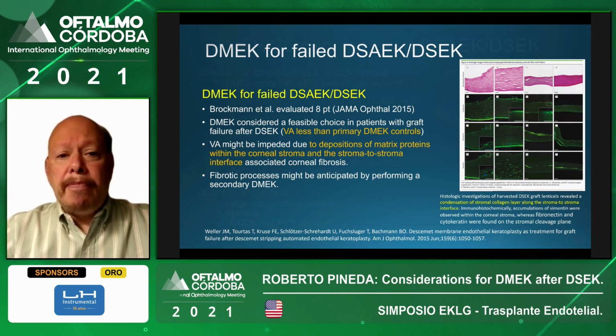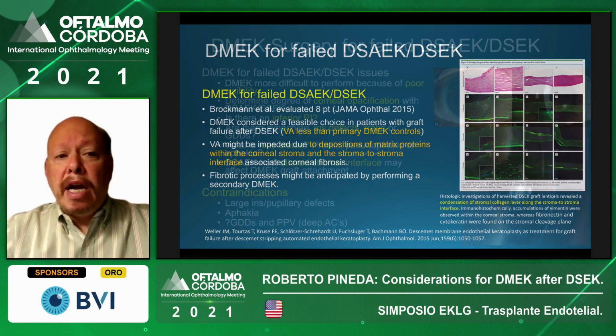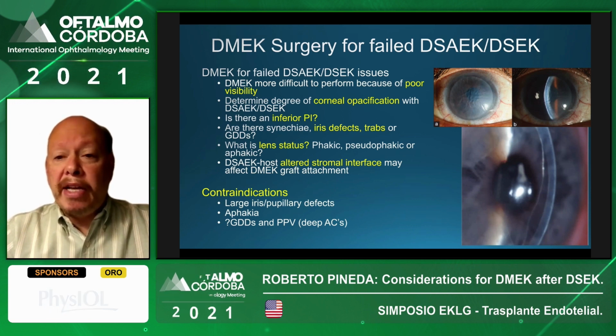So what are the considerations for DMEK surgery after failed DSAEK? Well, we've heard a lot about visibility this morning, and certainly the DMEK can be more difficult to perform because of poor visibility. It's important to determine the degree of opacification, as Dr.